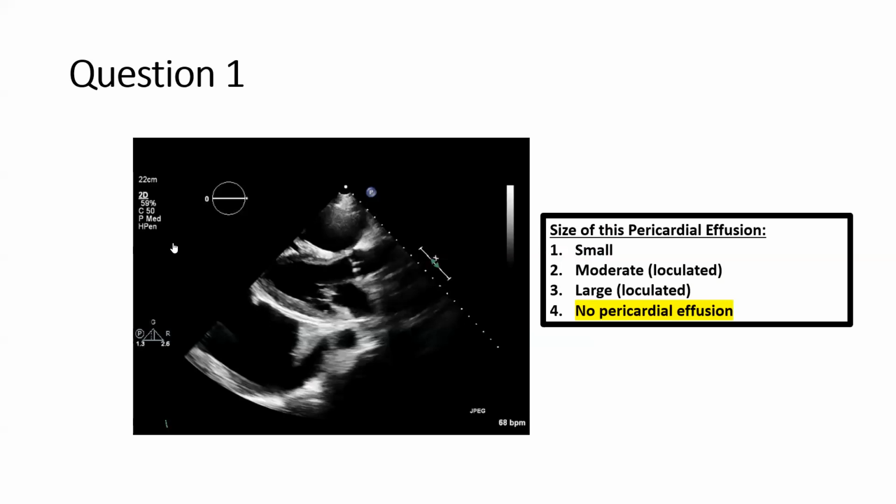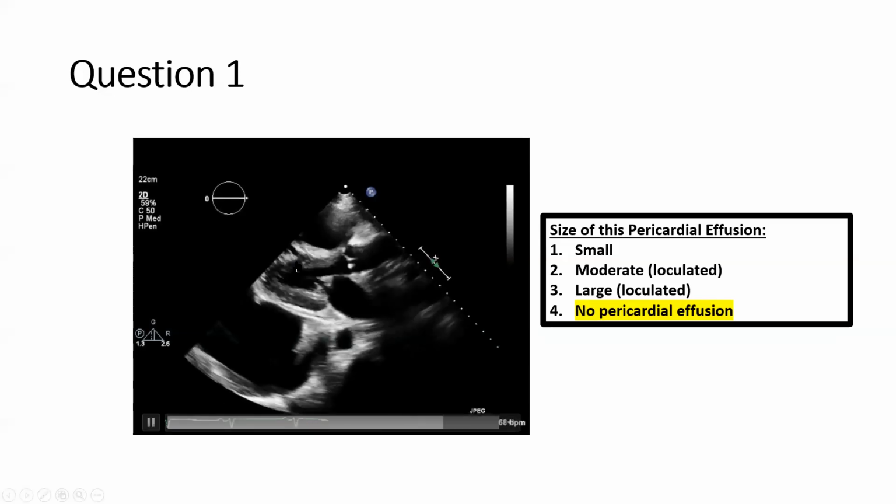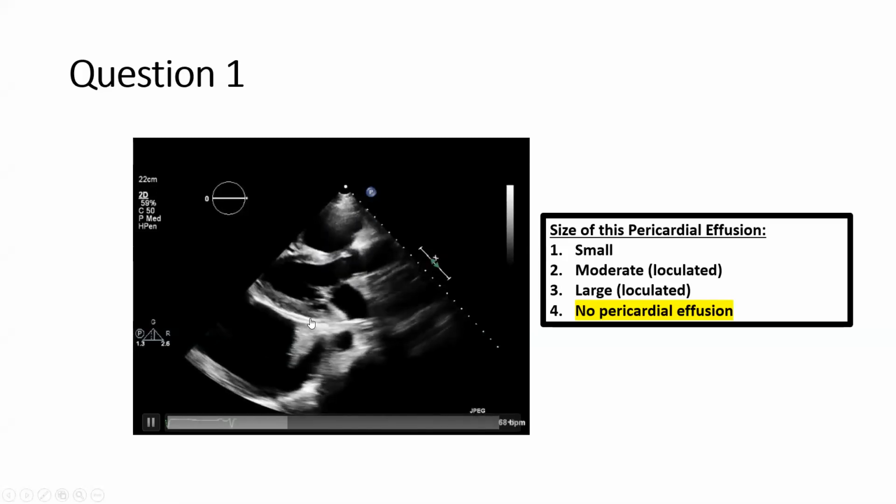Okay, coming back to our questions. First question, most people got this answer correct, right? Kofi or Jay? Yes, most people got this correct. Yeah, so the RV is actually big. I'll play it one more time. RV function is reduced, maybe a little bit of septal hypokinesis, possibly due to RV overload.